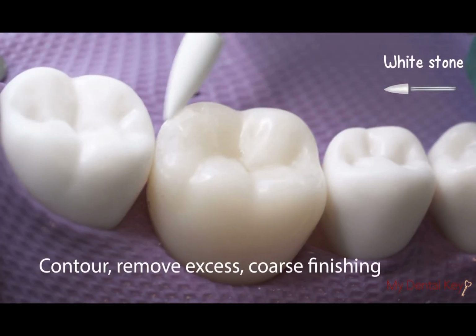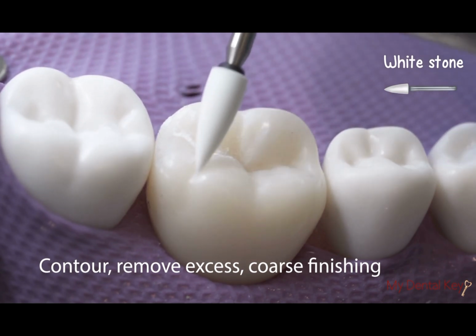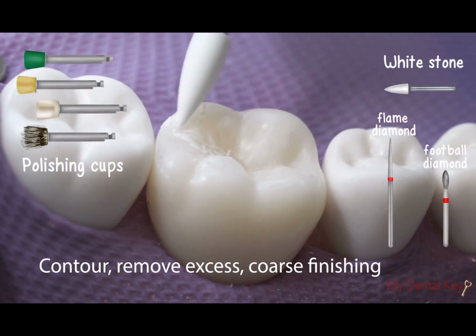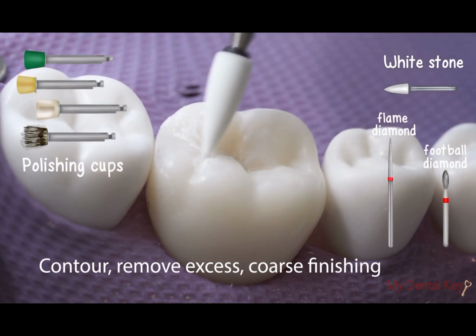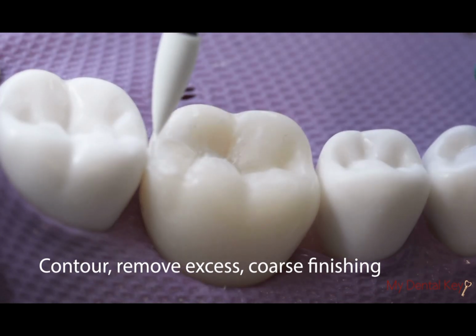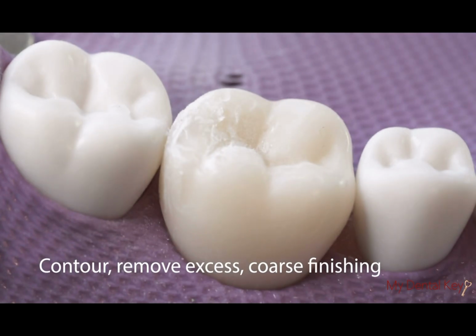Contour, remove excess composite, and perform coarse finishing of the restoration with rotary instruments. Use your finishing system of choice. Alternatives include diamond finishing burs or sequential polishing cups of differential roughness. When using a coarser finishing bur, such as the Whitestone, you can add anatomy to the restoration, which can be helpful for improving the appearance of the restoration.